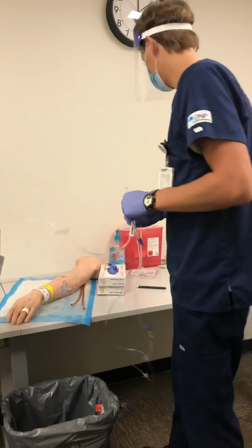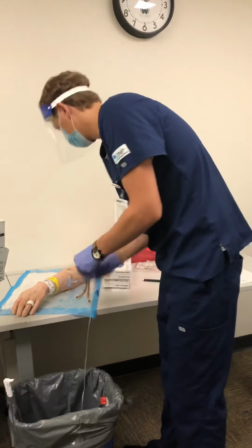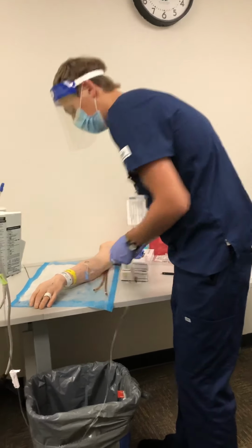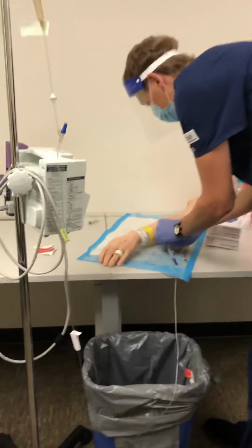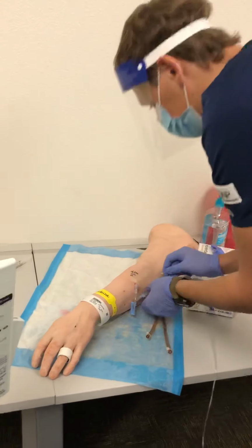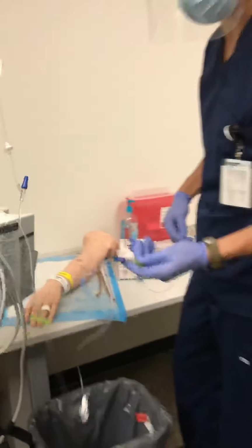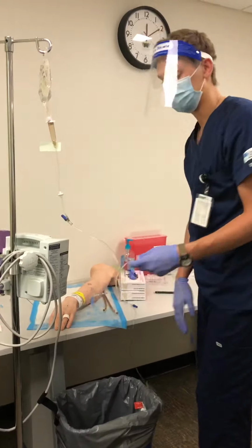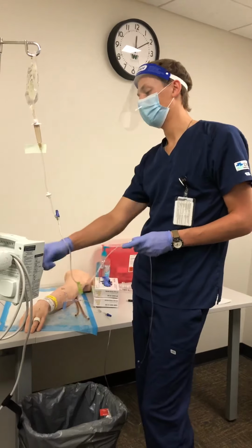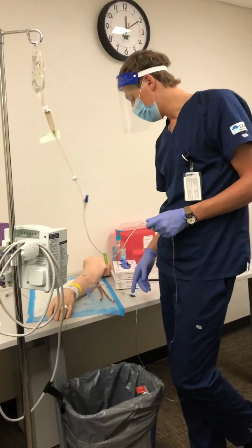Ready. And I'll just clean this one last time for safety measures. Making sure that the saline lock is open. Connected here, we're going to make sure all our locks here are off. That one's off. This one's off. And then this one's off. And then we're going to make sure to set our pump here at 125 mils per hour. And we do have flow coming.